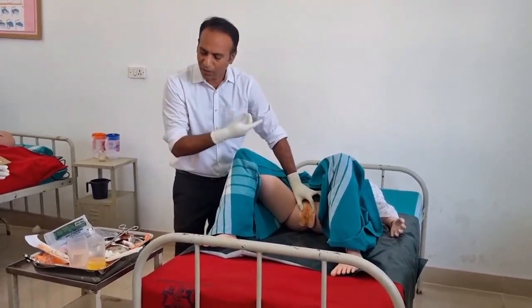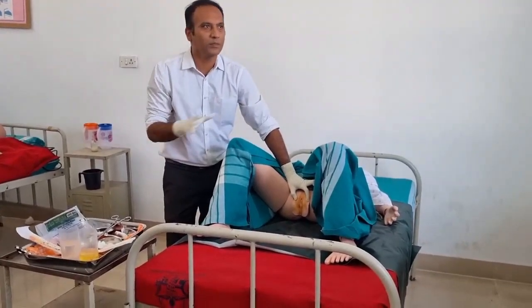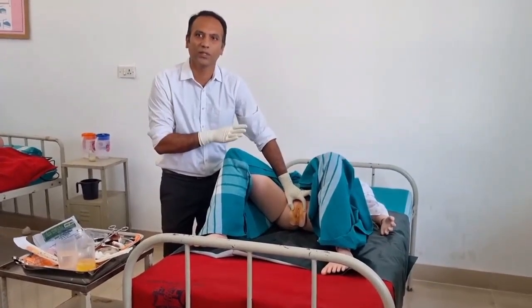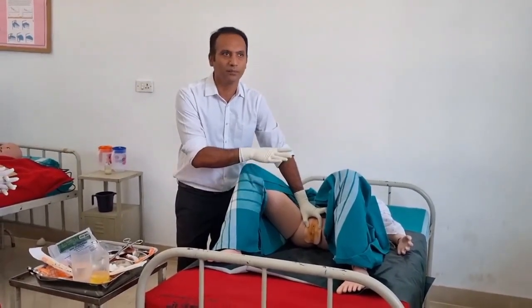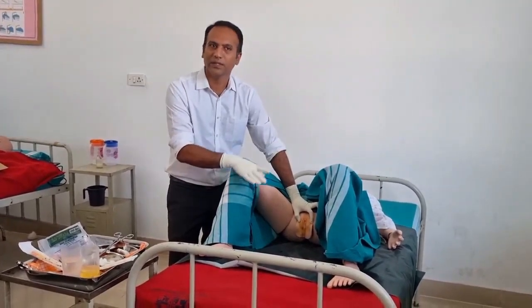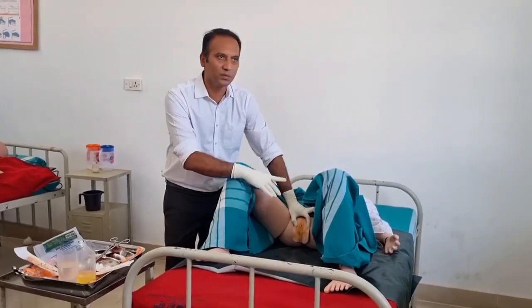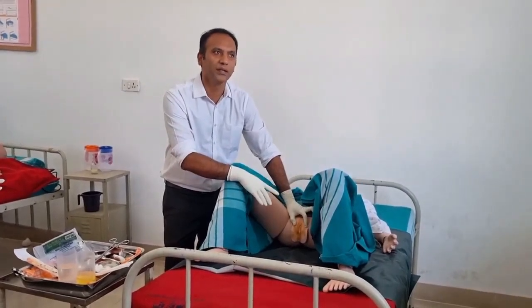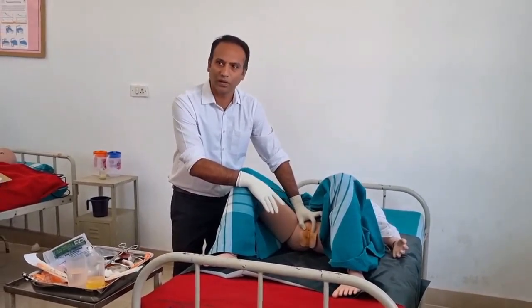Okay, so what I have done here, what I have shown in the procedure, the same thing you have to follow with the saline. So the cleaning strokes and the methods that I have shown, you are going to do it with the saline, right? Starting with clitoris to vagina. Secondly, slightly opening the labia minora.